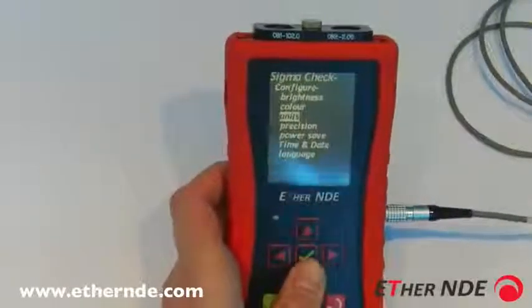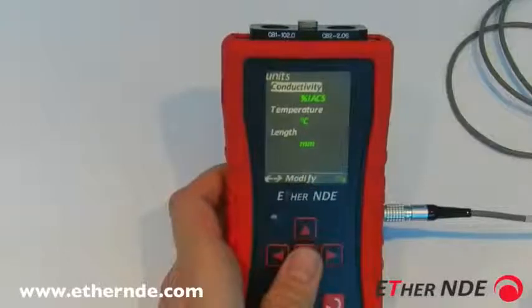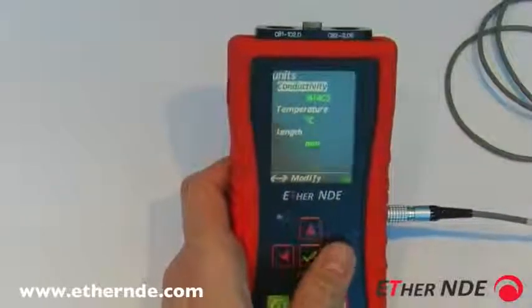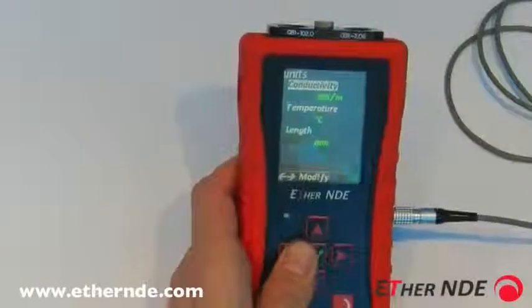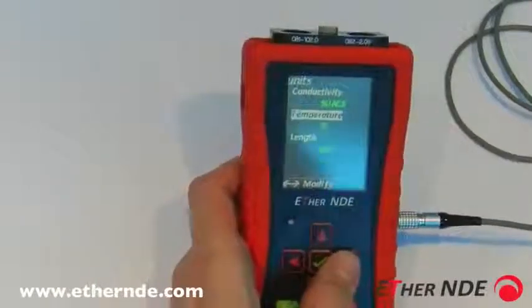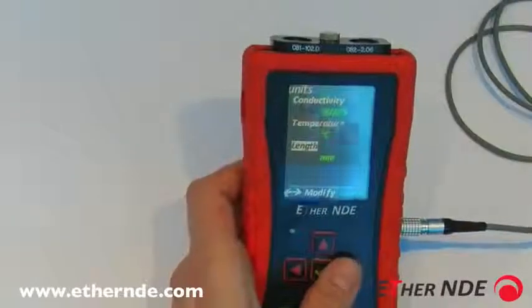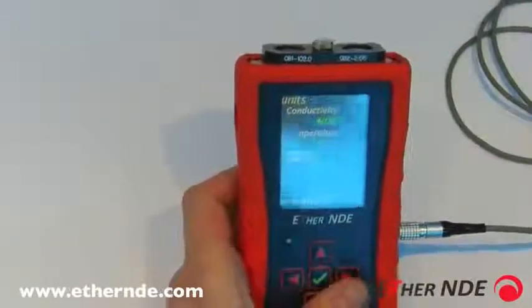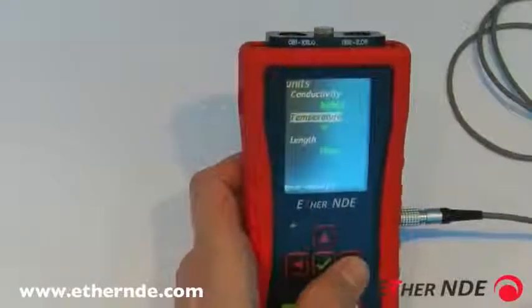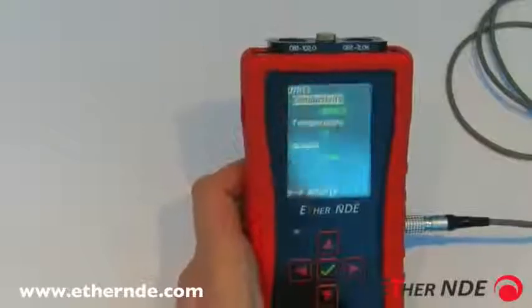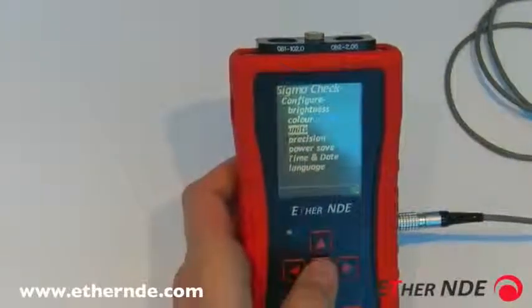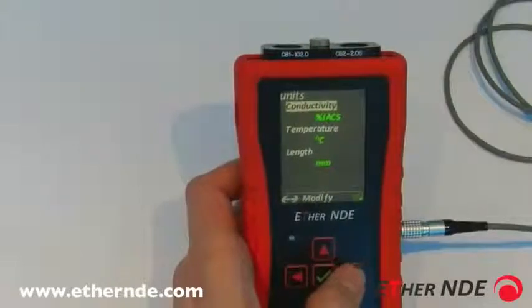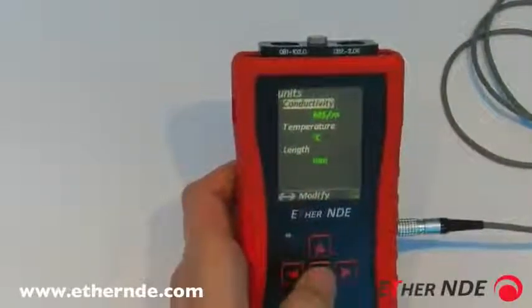The temperature flashing simply indicates we need to recalibrate the instrument. That covers color. How to configure the units: entering the configure menu and going down to units, conductivity, temperature, and length can all be configured. Options include percentage IACS and mega siemens per meter for conductivity; degrees centigrade or Fahrenheit for temperature; and millimeters, thou, or mil — both representing thousandths of an inch — for length.